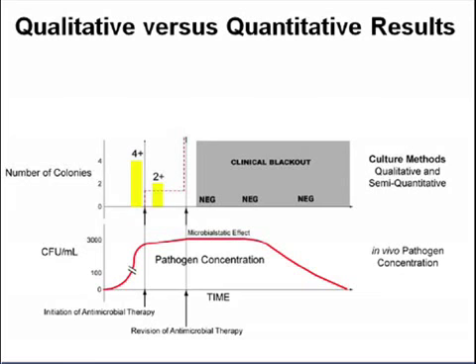As antibiotics were started, this amount decreased to 2+, and when antibiotics were in full effect, there is what we call clinical blackout, where the clinician doesn't really know what's going on in there, even though pathogens are still inside the patient, perpetuating a septic response. But since antibiotics are attenuating growth of the blood culture media and the organisms, we do not know what is going on with this patient.